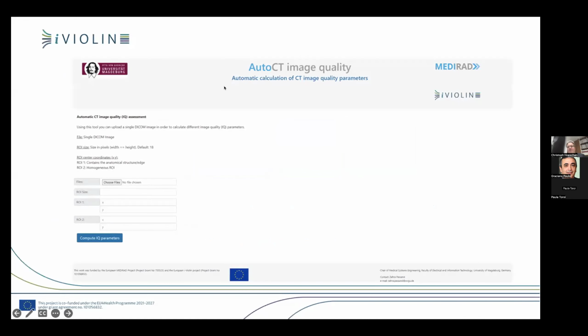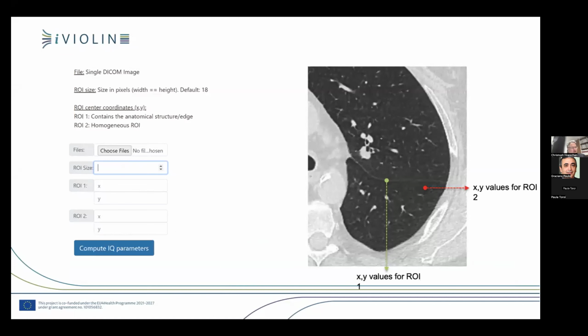And here's a program. This is how it looks. You can find it on the internet, it's called CT-IQA, at the OFGU website. And you put in some data. We are trying to optimize it so that it can be more automated. And also we will have to overcome one problem, because so far the classification is only on chest CT. So what we can do is determine the parameters, but it will not classify for other imaging types so far.